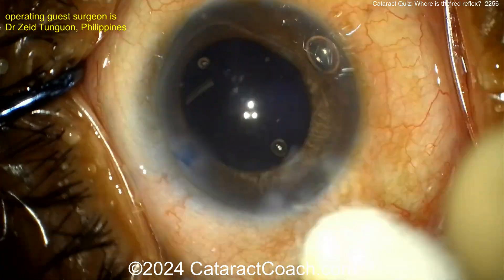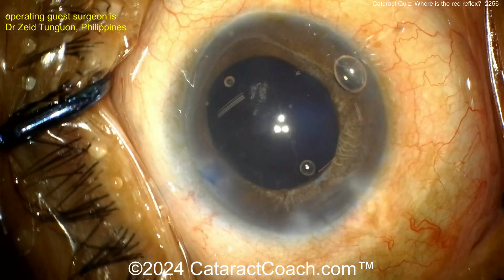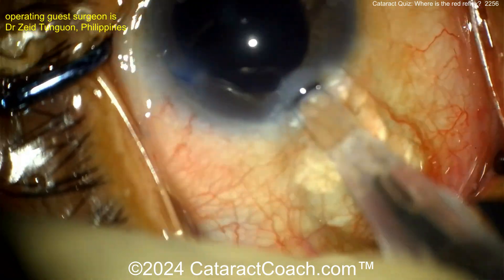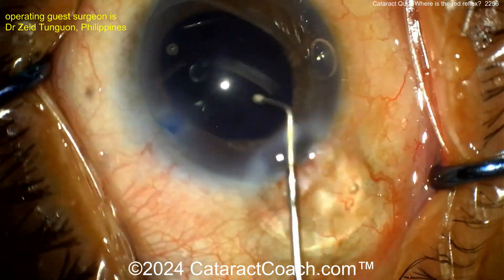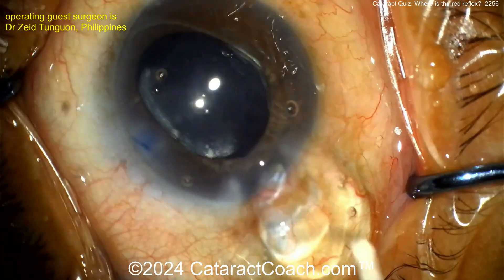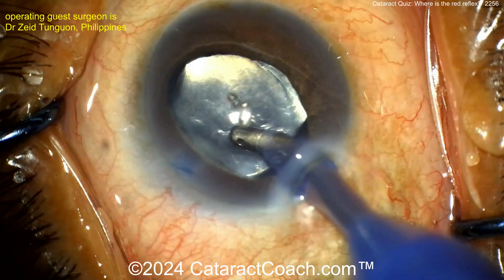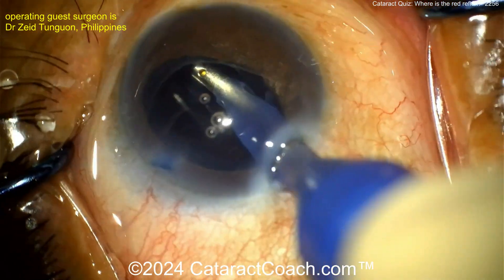There's a big viscoelastic fill. Let's see — checking the incision, making sure there's no vitreous, adjusting the lighting to get a better view. Still a tough view. Going for the lens — get that lens into the capsular bag. Make sure you open it up in the bag, as it's going to be hard to see the rhexis now because of the loss of red reflex. Make sure it's nicely in the capsular bag and not sitting in the sulcus. You can see from the reflections it's definitely behind the rhexis — beautifully done. It's a tough case.